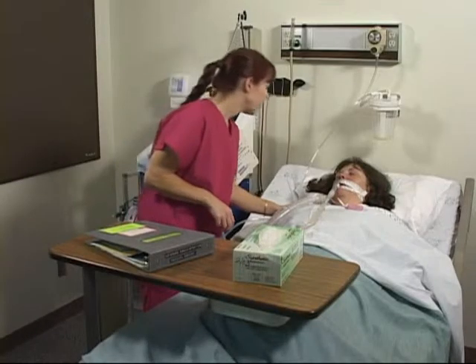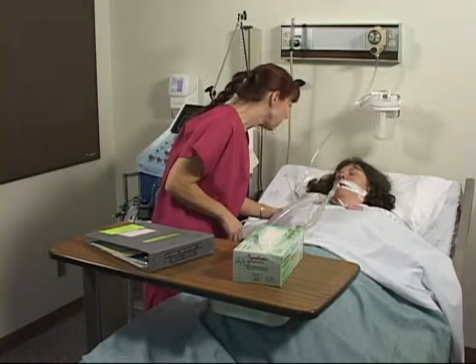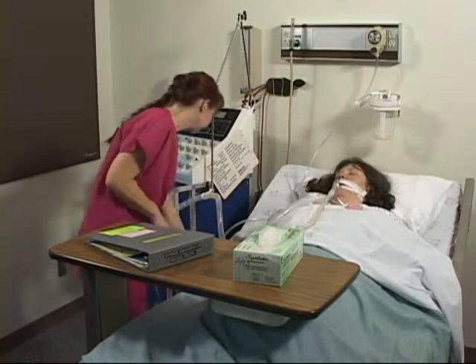Be sure to explain the procedure to the client prior to starting, informing him or her that suctioning often will cause people to cough or gag or even feel as if they are short of breath during the procedure. Telling the client why suctioning is needed might help to increase cooperation or tolerance. Throughout the procedure, offer frequent reassurance in order to reduce anxiety and minimize oxygen demand.